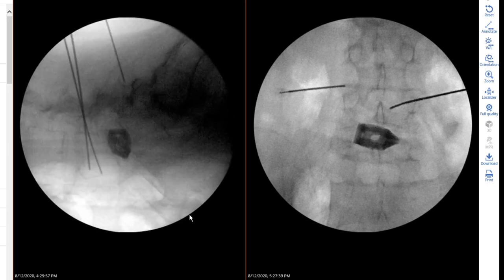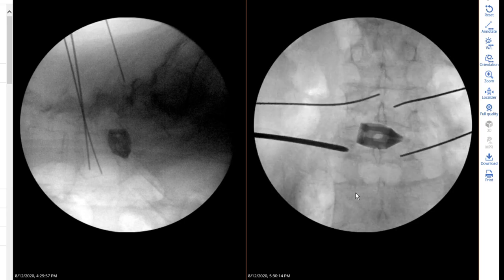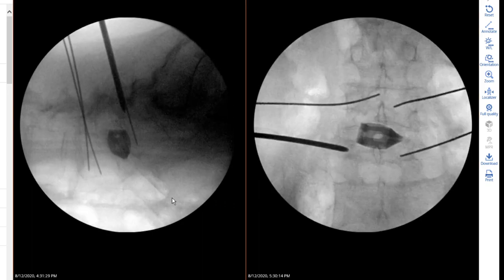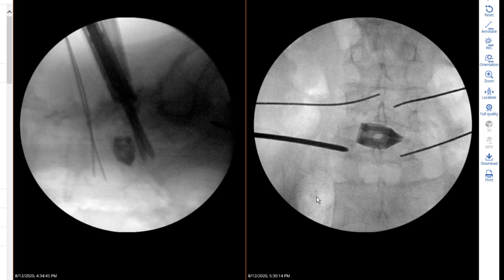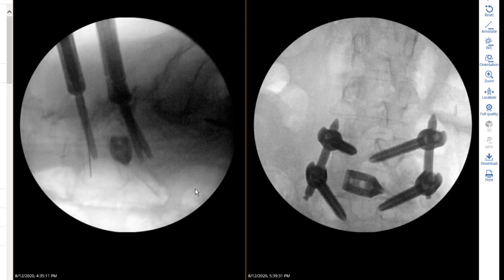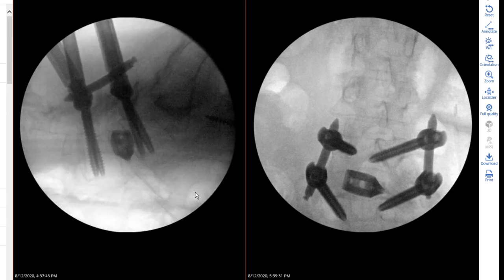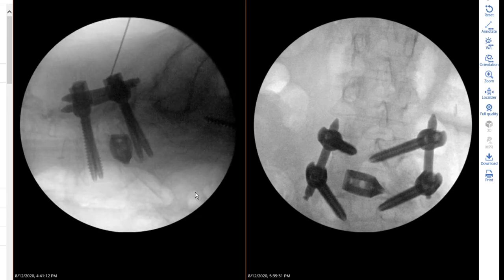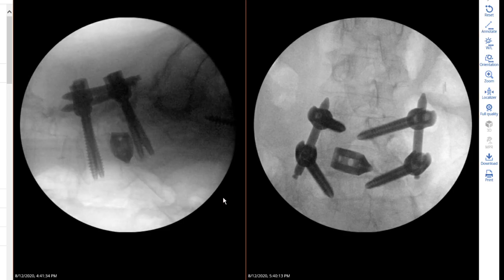Now we put the cage wires in at L4 and L5. After the cage wires are placed, we use the decorticator to roughen the surface of the facet and put bone marrow and tricalcium phosphate on it. Then the screws go in, first in L5 and then in L4, and then the rod is placed. Here we give an epidural steroid injection for postoperative pain management, and practically this is our final image at 4:41.